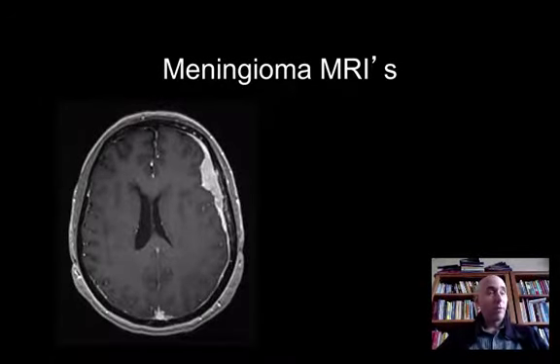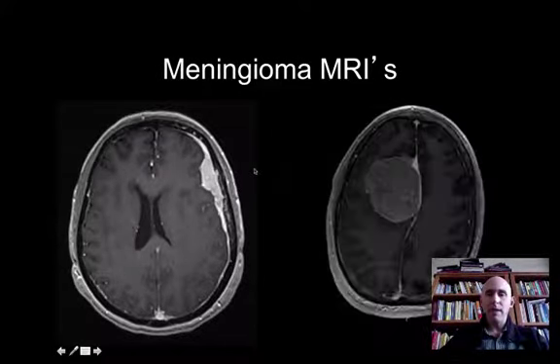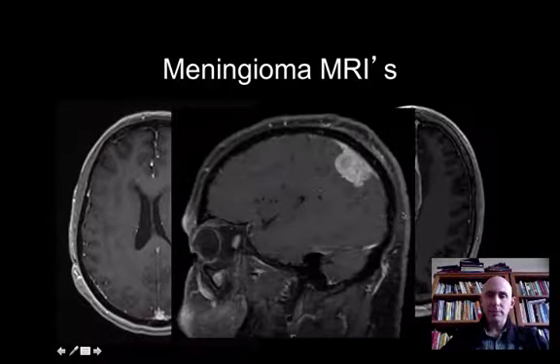Ordinarily, you hear report of or see dural-based lesions. So this is an example of plaque-like meningioma residing along the left convexity in a very, very long fashion. They can look like that. They can be more ball-like, sort of a large, still durally based lesion, uniformly contrast enhancing.